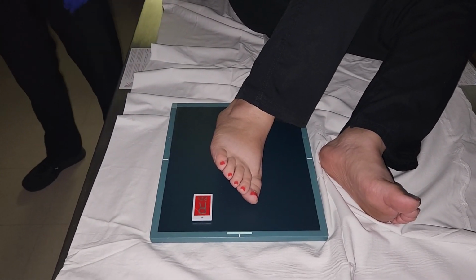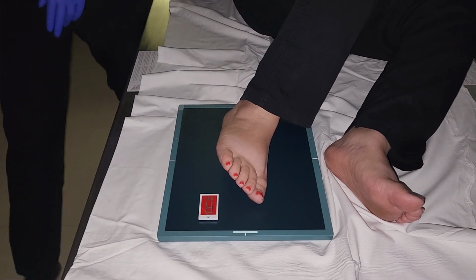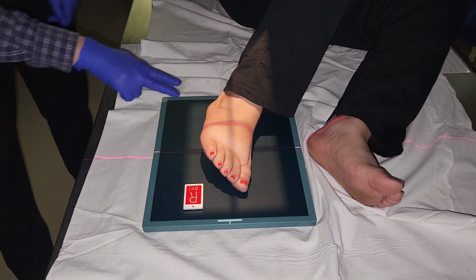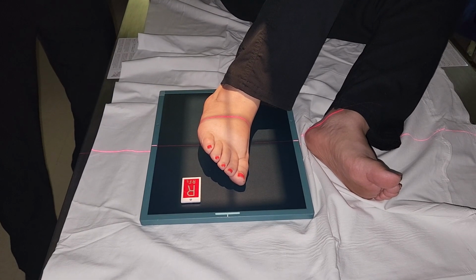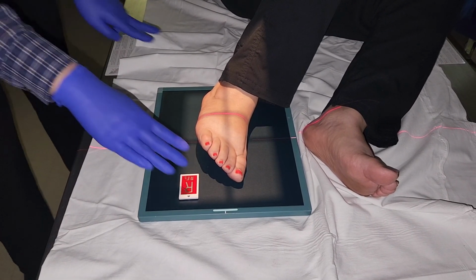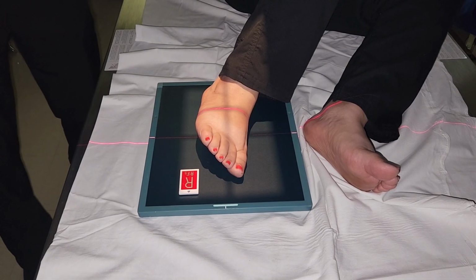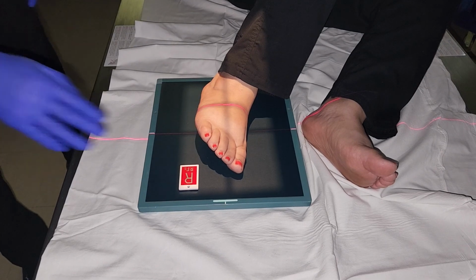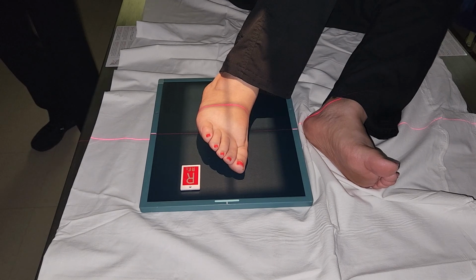Now, if you do have trouble finding the base of the third metatarsal, it's okay, don't worry too much. All you do is make sure the distance from here to here is about the same as the distance from here to here, right? Because the point of our centering is to make sure that we catch the entire foot. So, base of the third metatarsal. If you can't find it, don't panic. Just give yourself about equal amounts of collimation on either side.